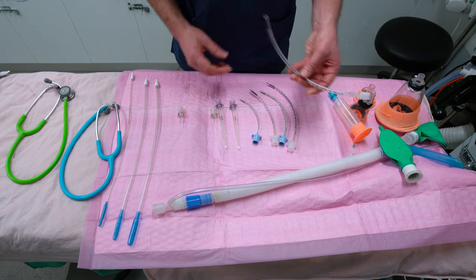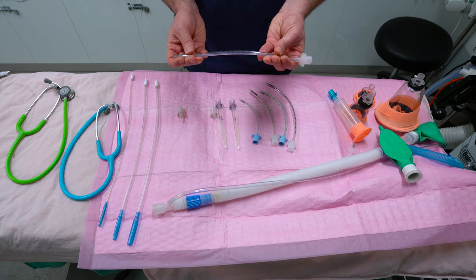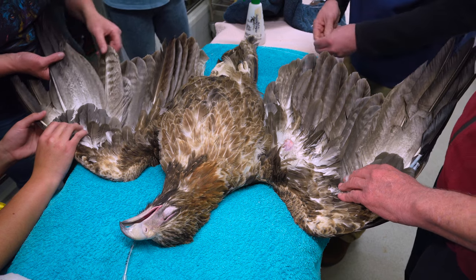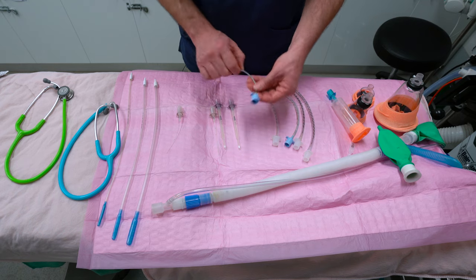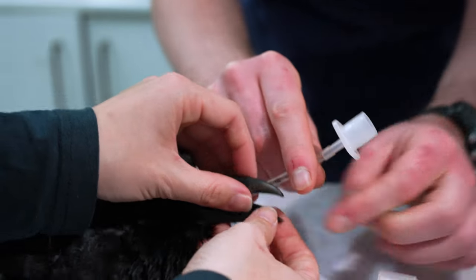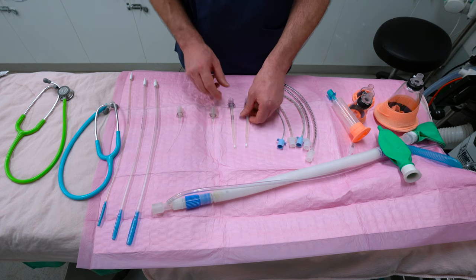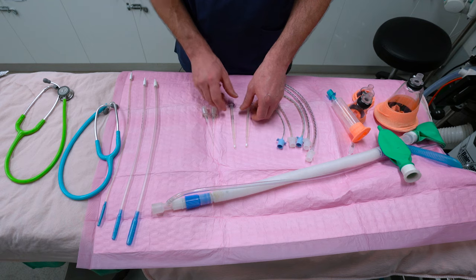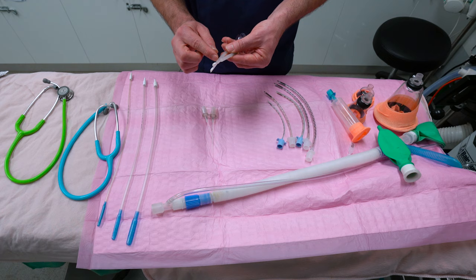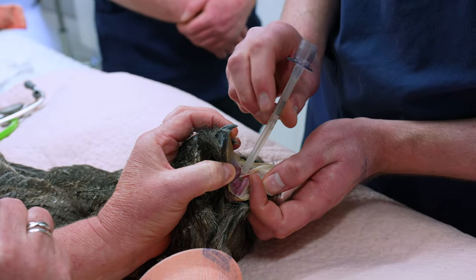We use normal ET tubes without a cuff. This size is probably suitable for any large bird of an eagle size or so, and then we have tubes down to two and a half millimetres suitable for smaller avian species. These are the more specialized bird ET tubes — made of silicone, they go into the trachea up to a step, and they work really well for birds.